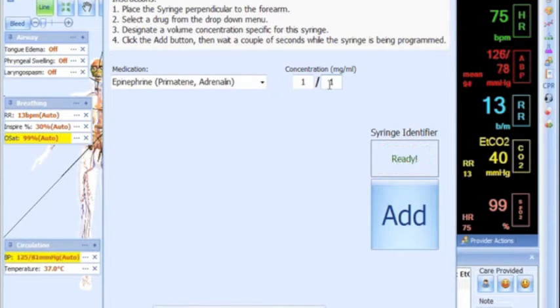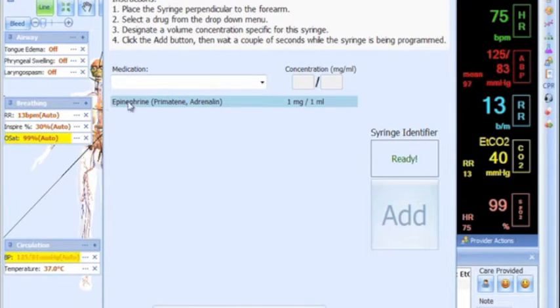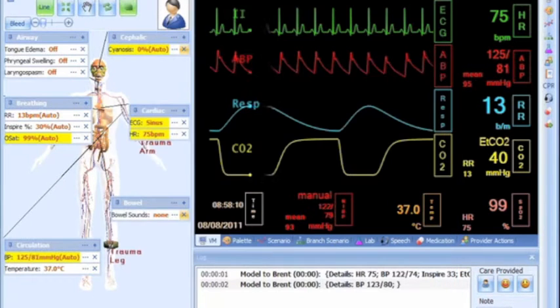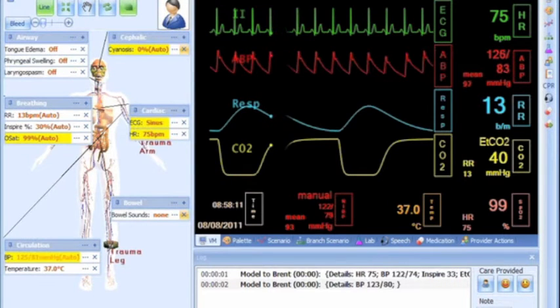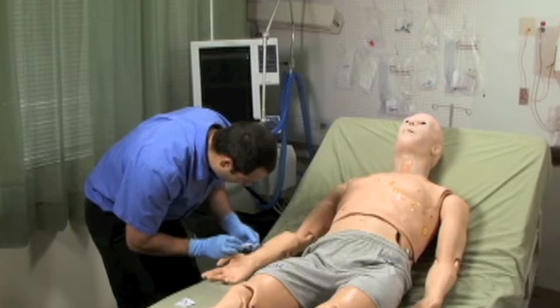Now, place the syringe perpendicular to the forearm, wait for the syringe identifier to show ready, and click Add. A list will appear on the window showing all programmed medications. As of now, only one syringe is programmed in.